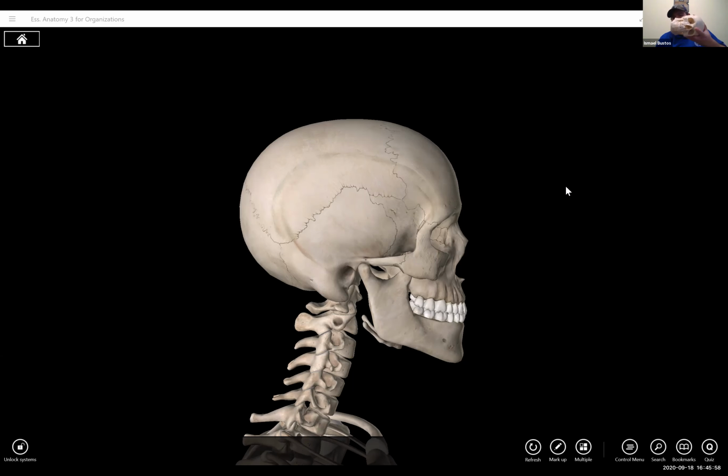He's on the image receptor, which is underneath. This interpupillary line needs to be perpendicular to the plane of the IR. That line is going straight down to the plane of the IR. That helps to prevent you from tilting the patient. Because remember, this is tilt. We don't want that to happen. So if we have that IPL perpendicular, if we tilt, we'll know that there's tilt because the IPL is no longer perpendicular. The other thing is the OML.